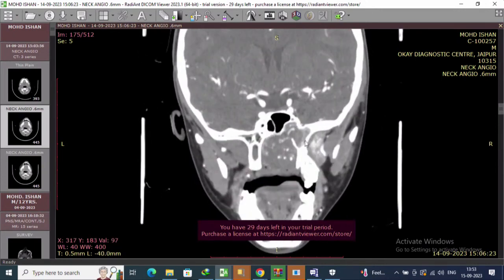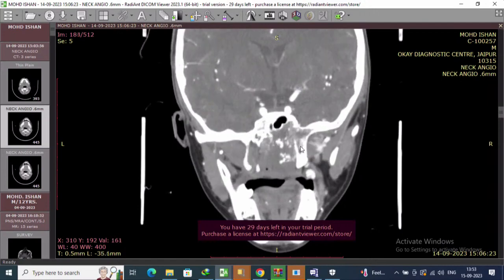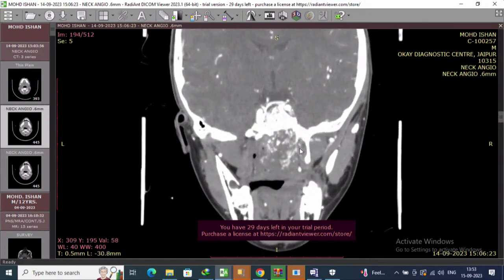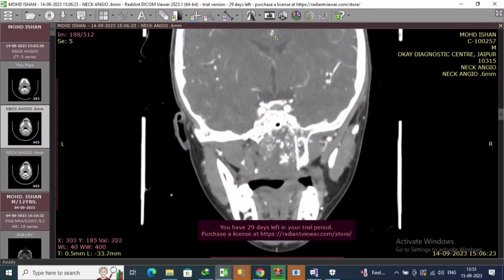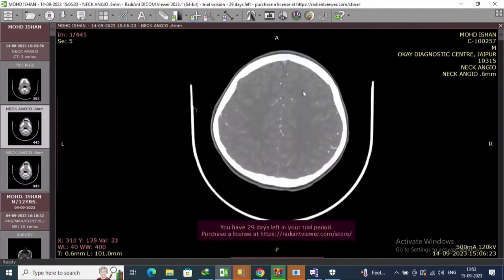Okay. Now, this erodes the pterygoid base, but it doesn't enter the pterygoid fossa down. See, pterygoid fossa down is absolutely clear. Yes, sir. It is the pterygoid base which is eroded. That is something to be noticed for this particular situation in this case.